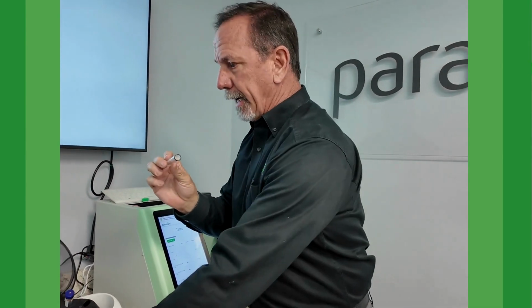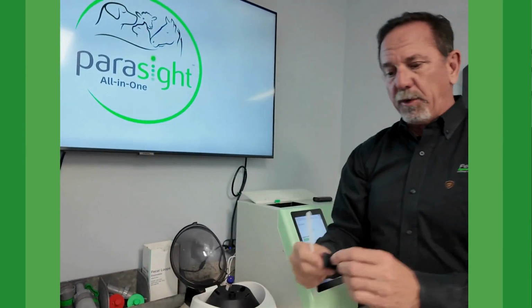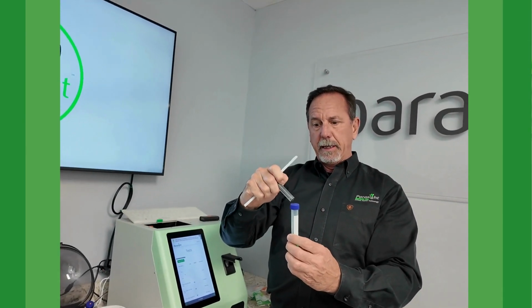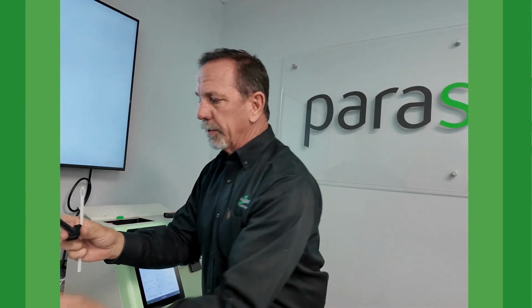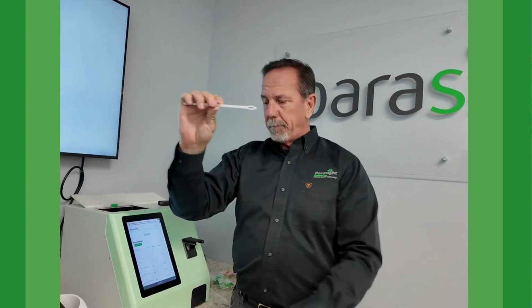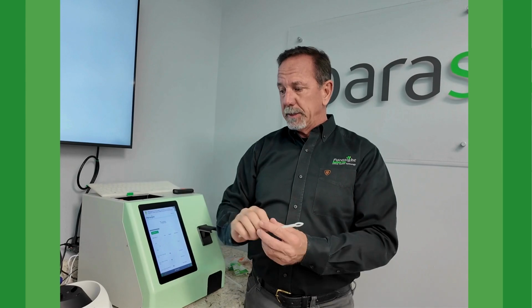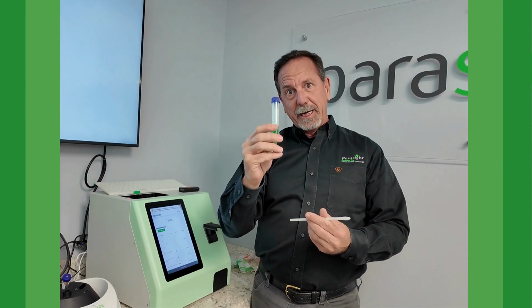Another misunderstanding is some people thought that if you use, instead of the 1 gram sample, putting that into the top of the tube before you shake it and spin it, what people will do is they've been using the fecal loop, and they thought because there was such a small amount of the fecal sample in there that you did not need to use the egg separator. You still need to use the egg separator.